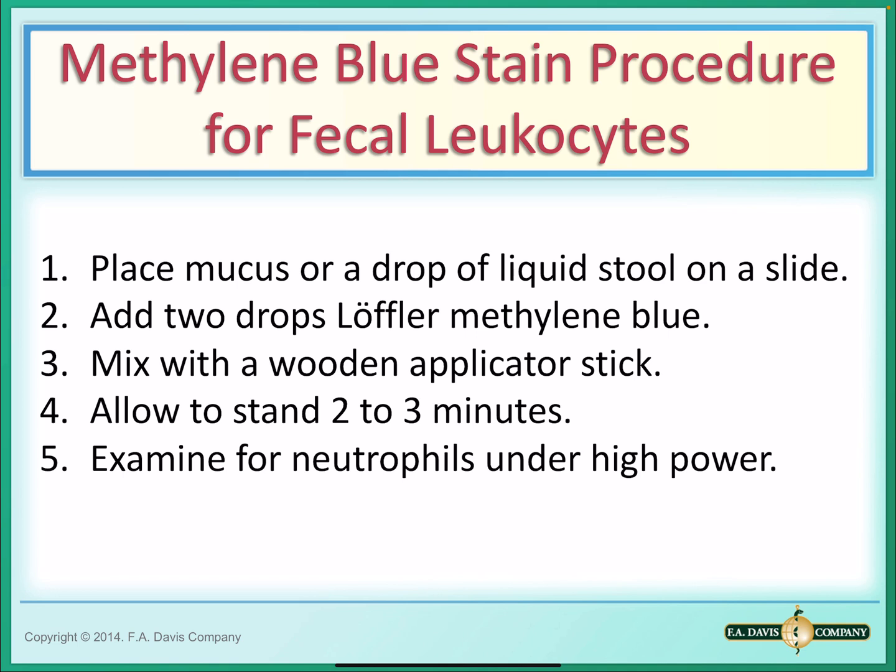Here is a procedure for analyzing fecal leukocytes using the methylene blue stain. First, you will place mucus or a drop of liquid stool on a slide. Then you will add 2 drops of Loeffler's methylene blue. You will mix that with a wooden applicator stick. You will allow this sample to stand for 2 to 3 minutes, and then you will examine for neutrophils under high power.